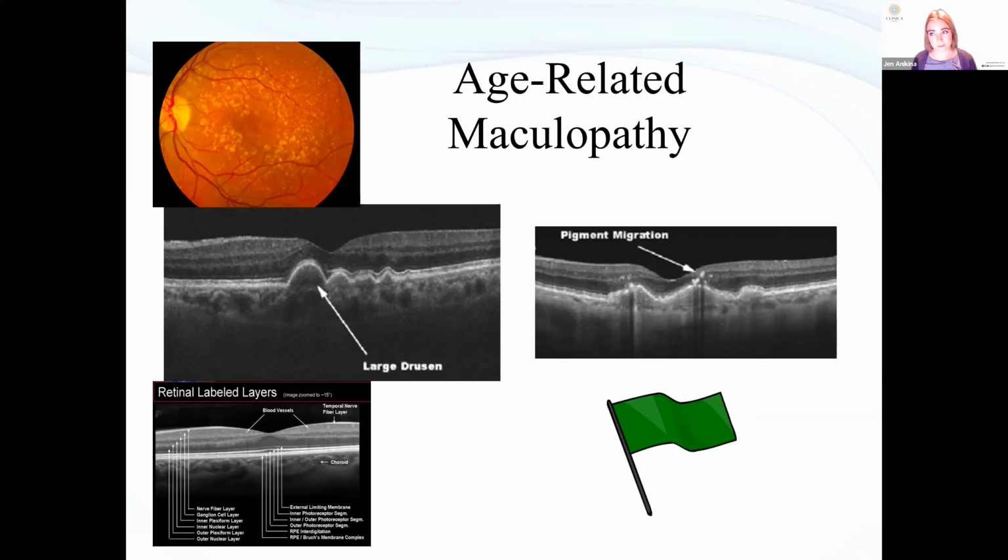I'm not going to cover it very much in this. I've got a whole separate talk on that. But the answer is you look at the patient clinically, and if it's red, it's subretinal hemorrhage. And if it's white, with perhaps a few red specks, then it's choroidal neovascular membrane. That's the simple answer.